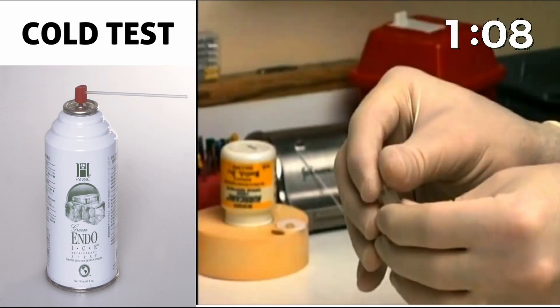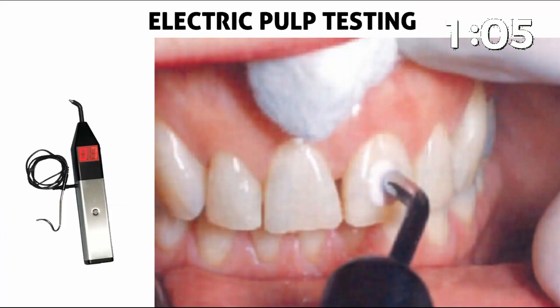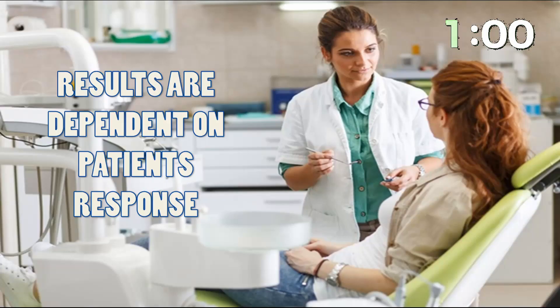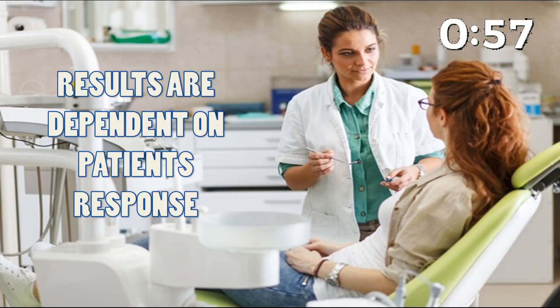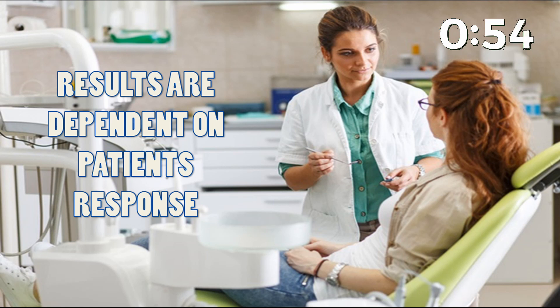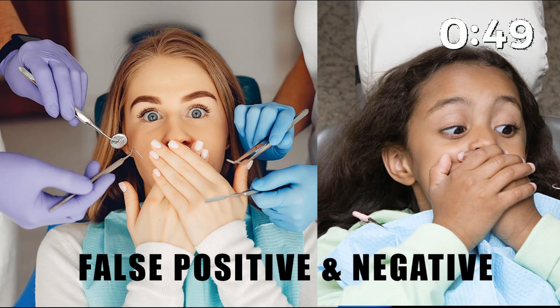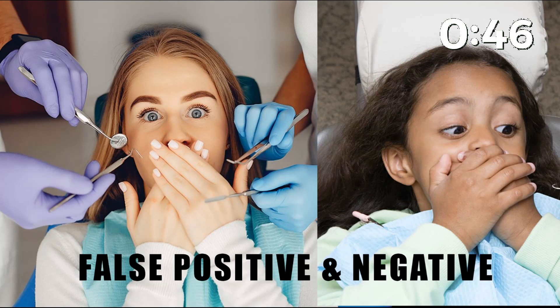Electric pulp testing can be carried out with the electric pulp tester, starting from a slow to a higher reading. For all these tests, the results are always dependent on the patient's response. Some patients may be very apprehensive, and some may not give any response at all. This leads to a higher chance of false positive and false negative results.